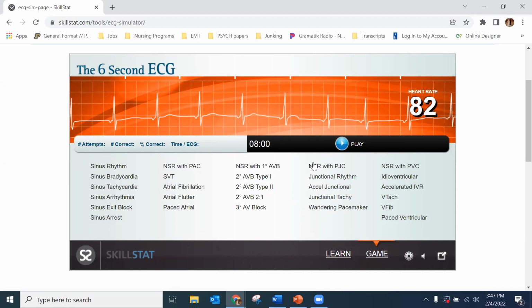I have a question. Yeah, go ahead. See how the one T wave just has that little hump? Oh, this one? Yeah, does that mean anything? Not that I know of. I'm sure technically yes, but no. Okay, thank you. Nothing you would need to know. But yeah, that's a good catch actually. I kind of wanted to ask too, do PJCs normally not have a visible T wave as well?